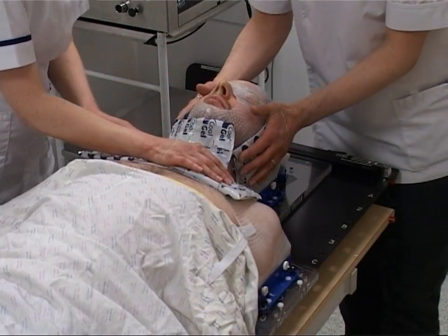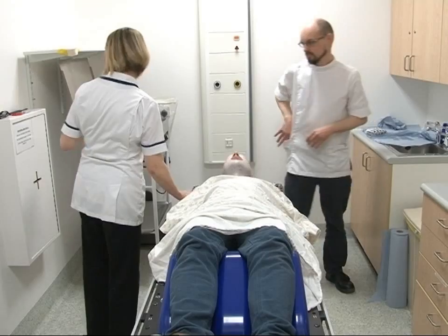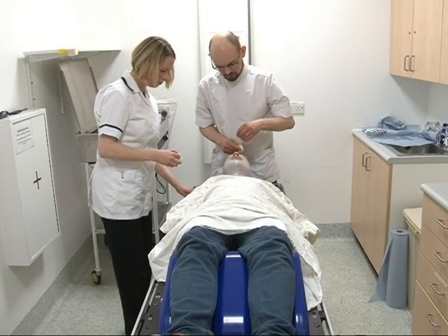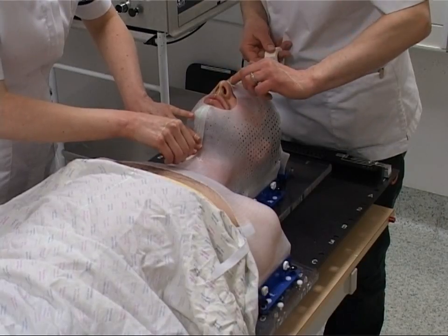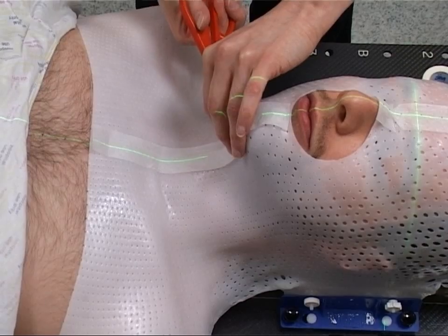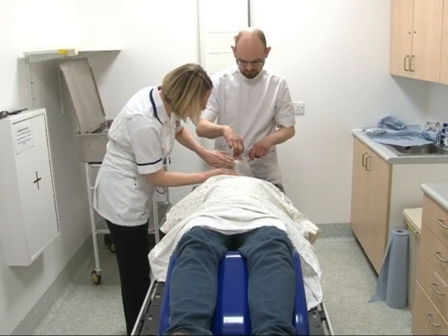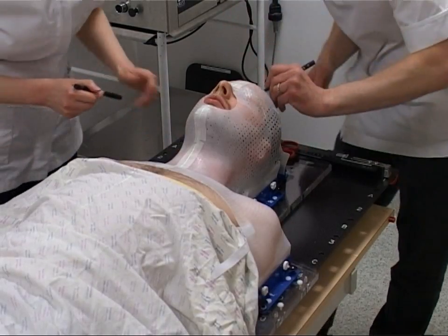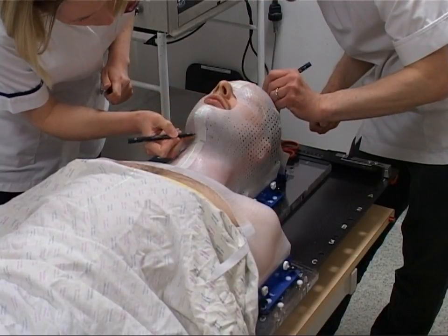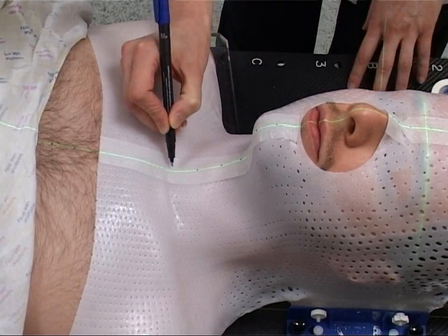It takes about five minutes for the mask to set. Once the mask is dry and hard, a strip of tape is placed along the length of it over your forehead, nose and chin. You will just feel the tape being applied. A dotted line is drawn along this and will be used each time you are positioned for treatment.